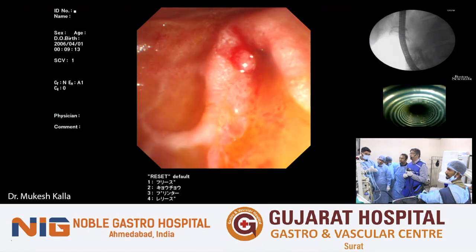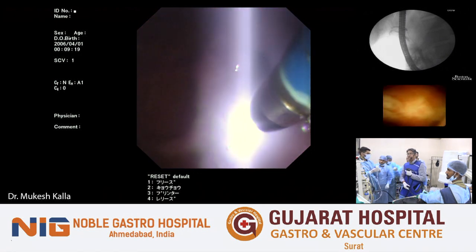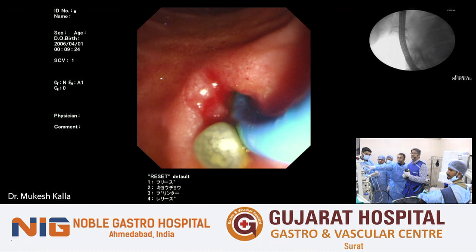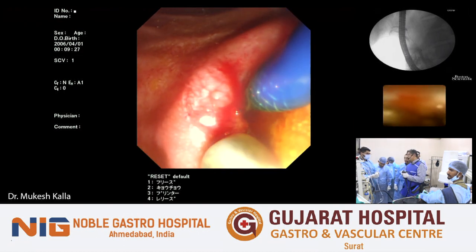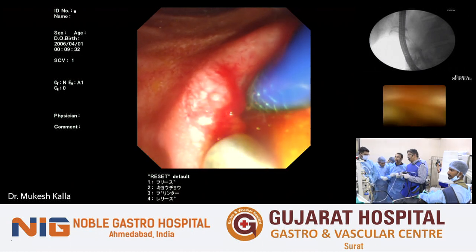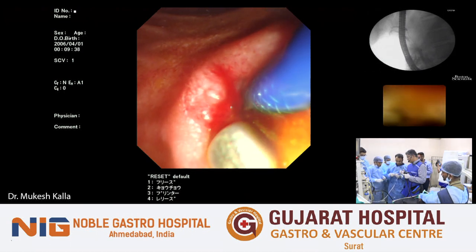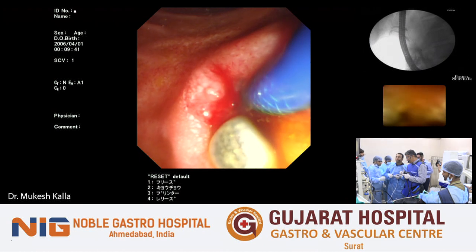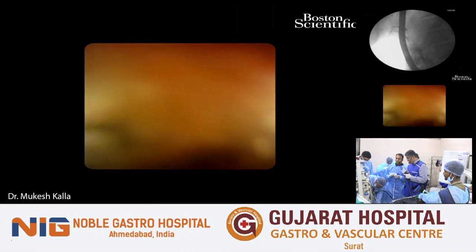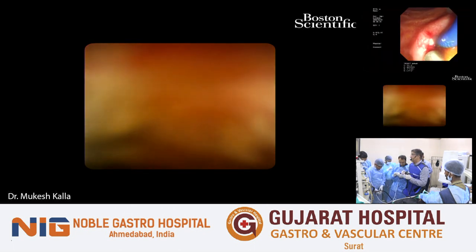Okay. Yes, Sovin, Sandeep here, sir. See, when we are doing cholangioscopy, do you really need to put contrast? Yeah, that's a wonderful question. So I presume you are asking me that when you are going inside the common bile duct, what's the point in pushing contrast, because that might create difficulty in visualization of the common bile duct through a cholangioscope, right? Yes. See, it's better to have a roadmap. And Dr. Naveen was telling us that he is using 2:1 or 3:1 diluted contrast for the job.